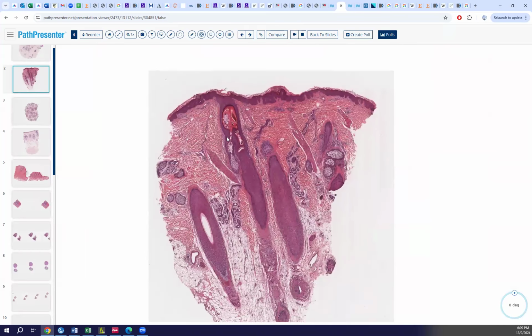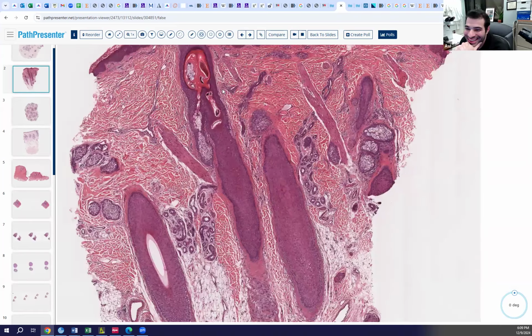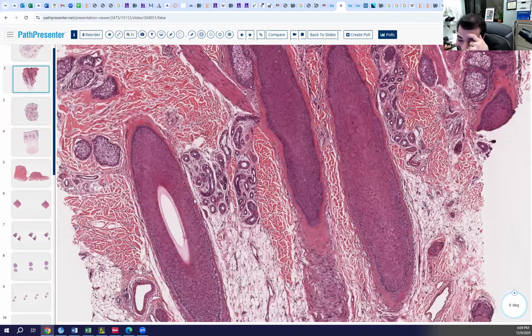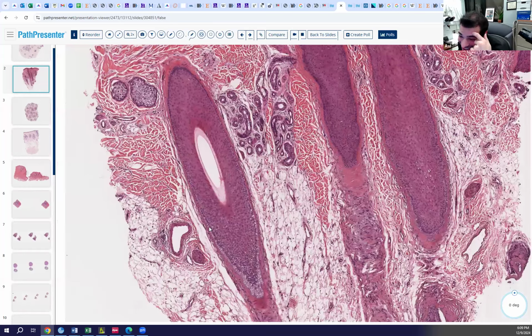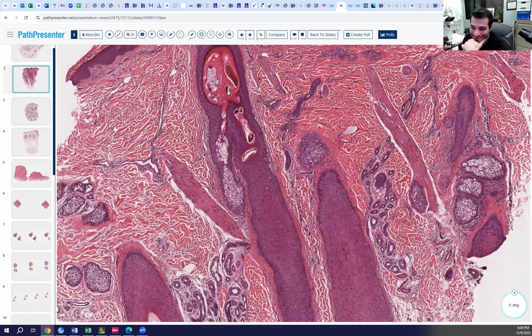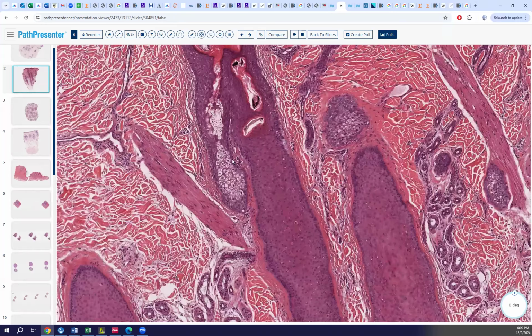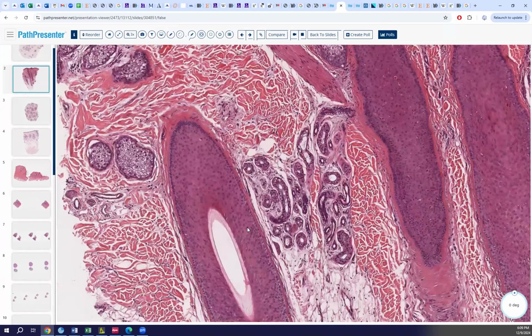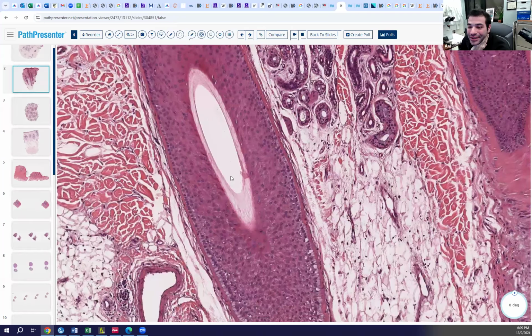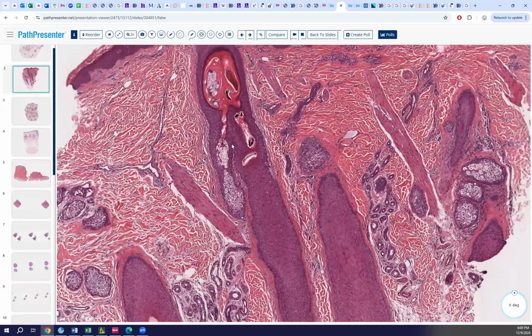Collapse of the inner root sheath is something too. People talk about collapse of the inner root sheath, premature desquamation of the inner root sheath. Just collapse of the inner root sheath is different: the hair shafts have been yanked out, so you won't see that little clear area.